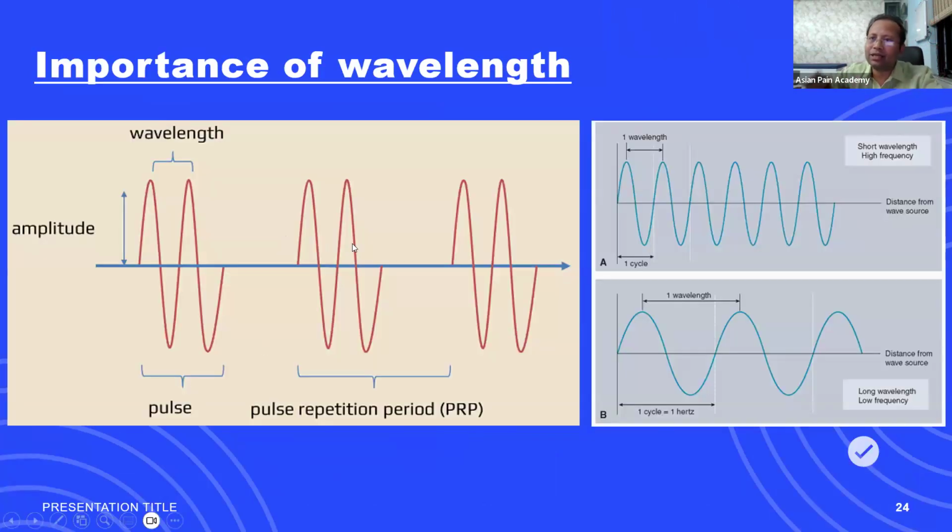So as I told you, where is the difference? You can say that for the same distance, more cycles will be there. So here lies the difference: the attenuation. The attenuation amount, say from the first cycle, the second cycle becomes 10% smaller. The third cycle becomes another 10% smaller. The fourth cycle becomes another 10% smaller.